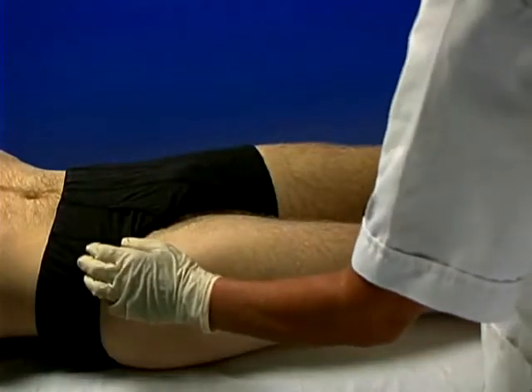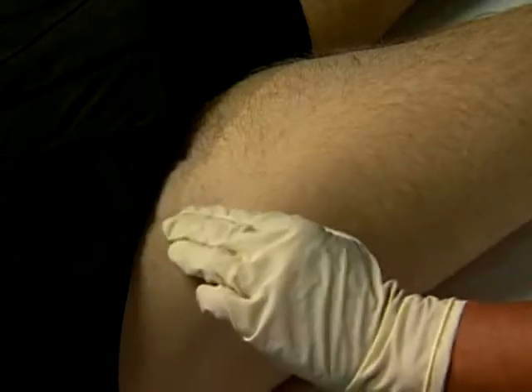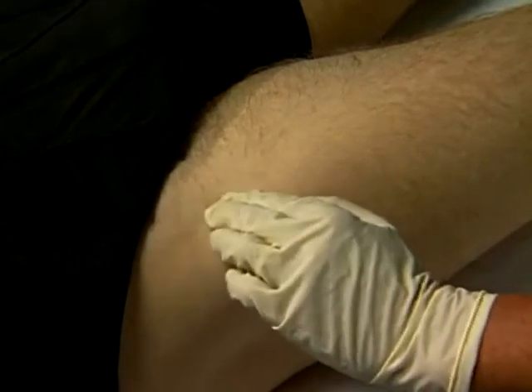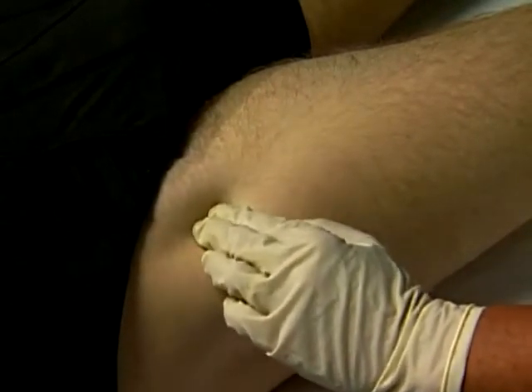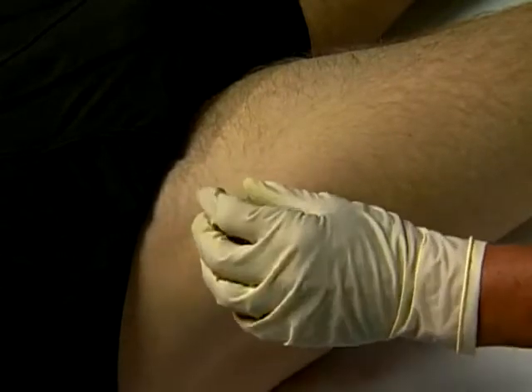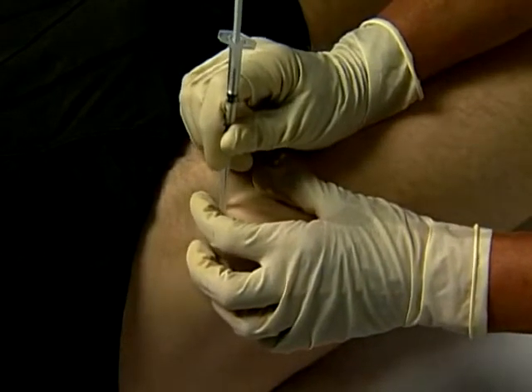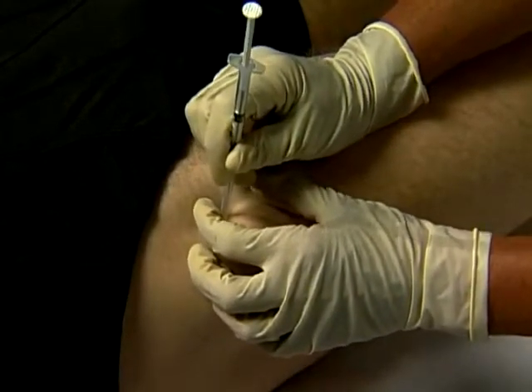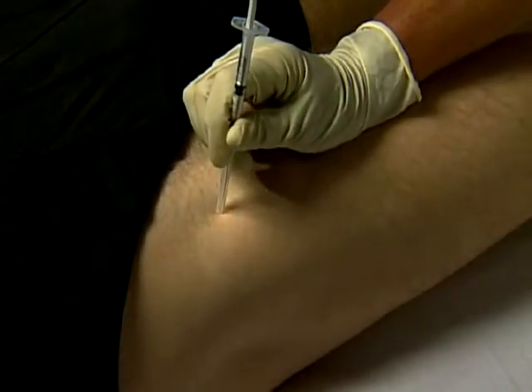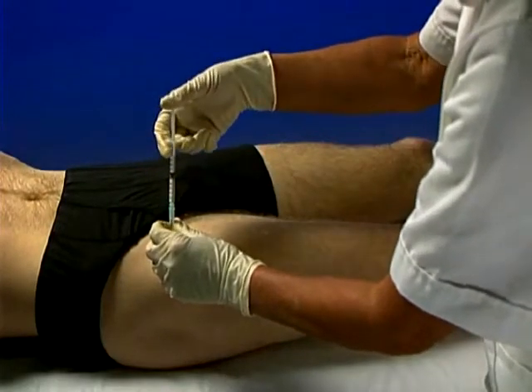Identify the anterior superior iliac spine and move immediately distal. An area of tenderness is usually found about a hand's width below the spine. Mark the entry point here, clean and firmly stretch skin, and rapidly insert needle perpendicularly. Pass needle slowly down into quadriceps muscle. If a burning sensation is felt, reposition, aspirate, and inject solution as a bolus around the nerve.